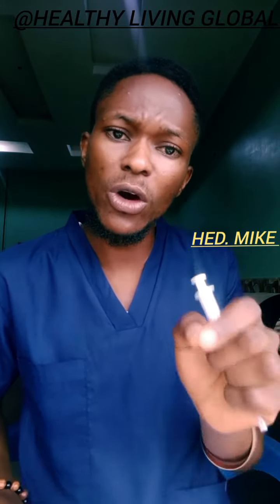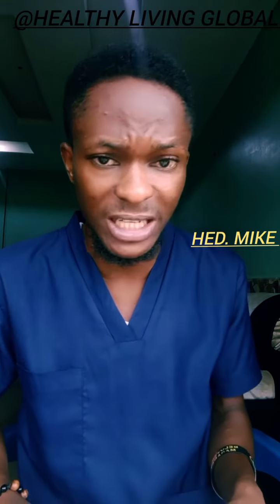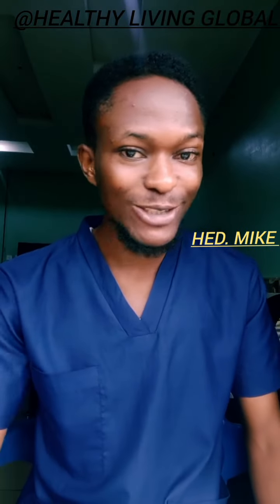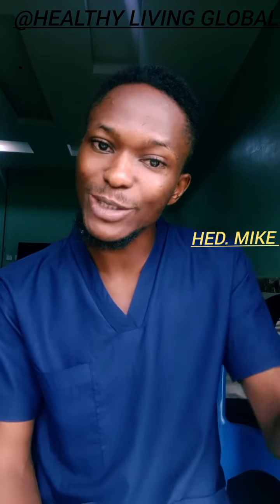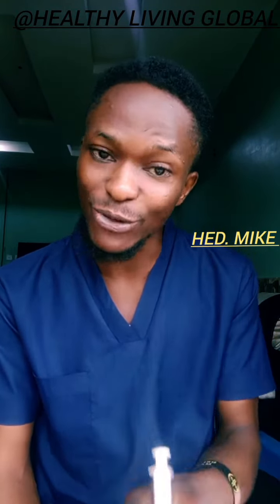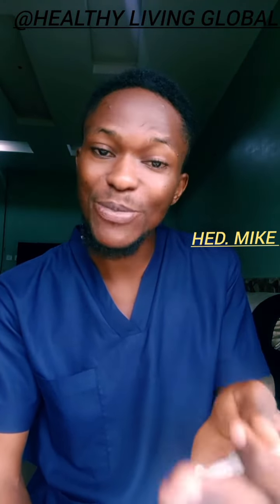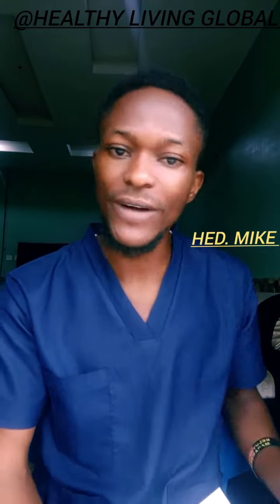And another goal is for you to make sure you did not give the patient injection abscess, and also you did not introduce infection to the injection site. Another goal, which is very important, is that you try as much as possible not to transmit an infection or a disease from the patient to yourself, because if you are not careful, you put the needle back in the cap and it pierces your hand, you know what it can result in. You know that many people have contracted HIV and other diseases through this. Be careful. All right, let's go now.